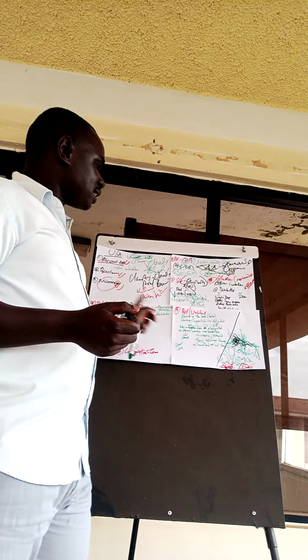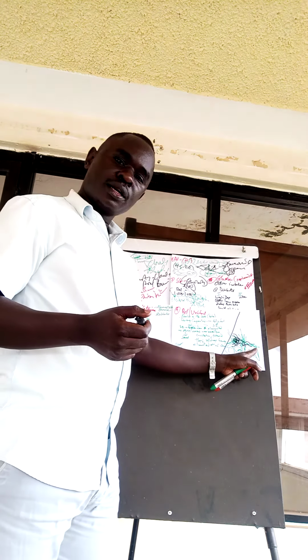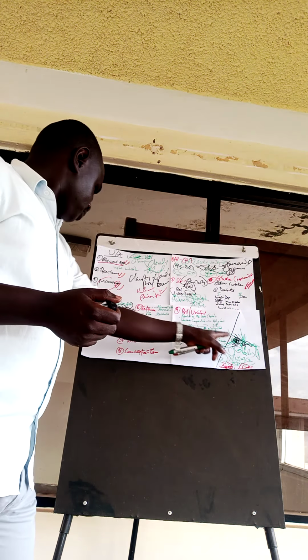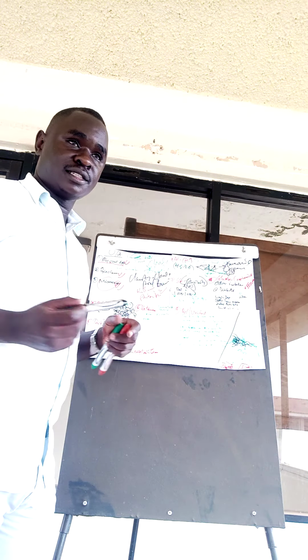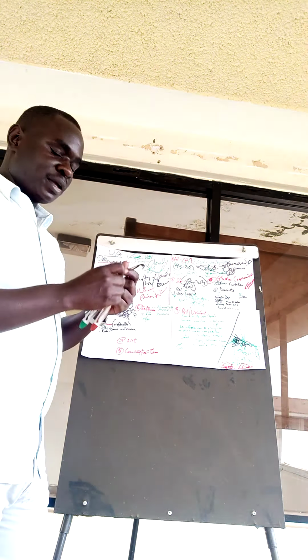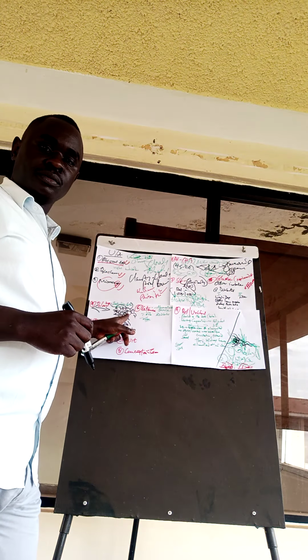But when there is excess hemoglobin or myoglobin in urine, it could mean, for example, that someone has undergone strenuous exercise. When one goes through strenuous exercise, the muscles tend to produce a lot of myoglobin.